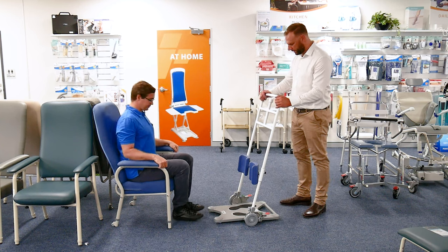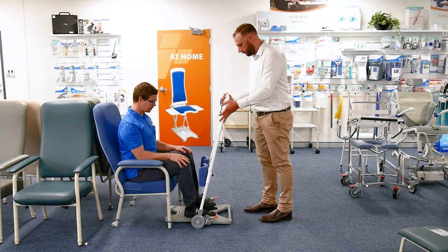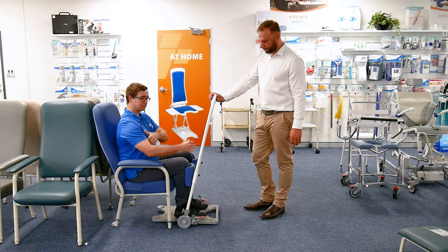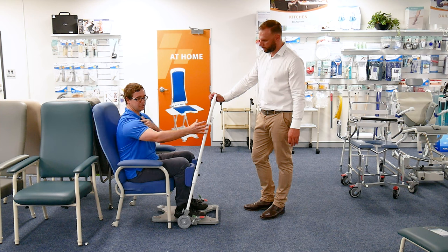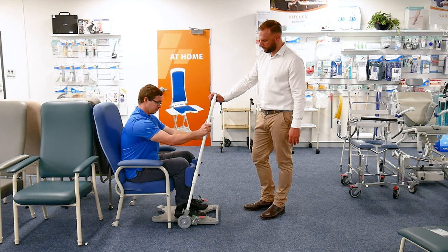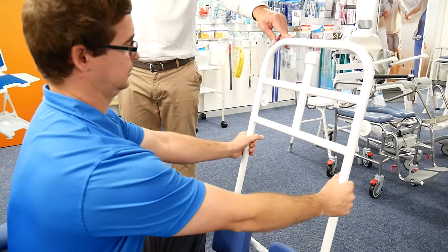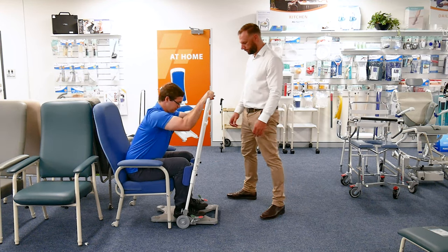Let's do a demonstration. One of the first risks is getting the person's foot up on the device and bringing it nice and close. Brakes can be on. I can then reach up — sometimes people will have an issue reaching forward. Even though this doesn't look like much shoulder movement, somebody could be living with rheumatoid arthritis or severe arthritis and find that hard. So they can start to shuffle themselves forward. Ideally we want them reaching where's comfortable for them to do a pull-up, which will vary depending on torso length and arm length.